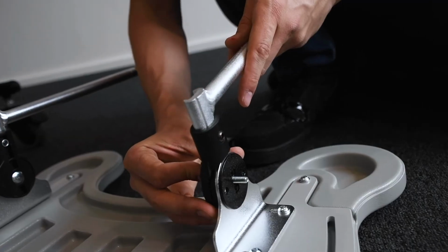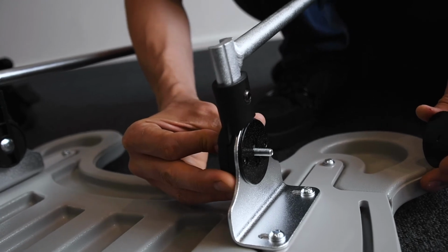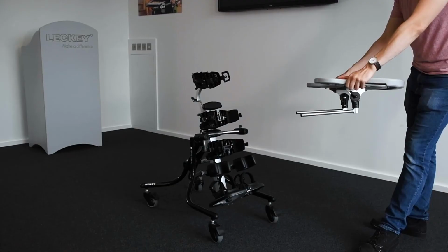To attach the arms to the tray brackets, loosen the knob, place the moulding to the inside of the tray plate, replace the knob on the outside and secure. Repeat on the other side.